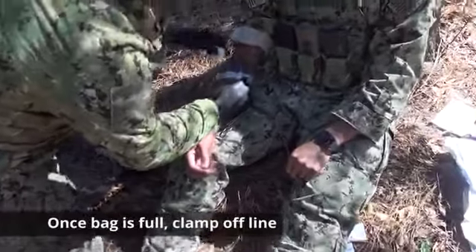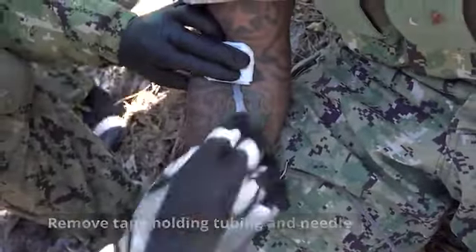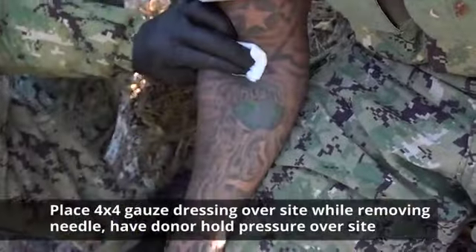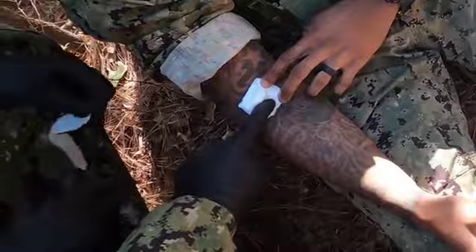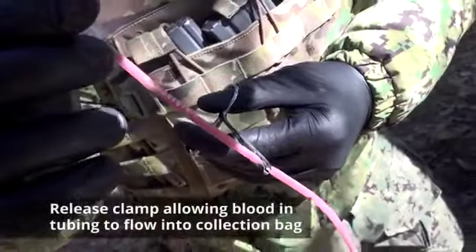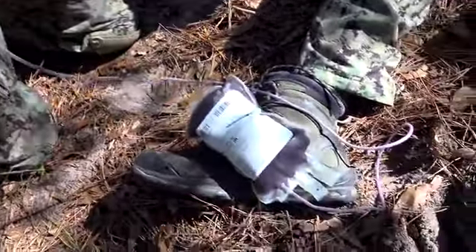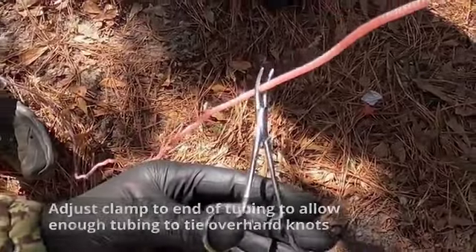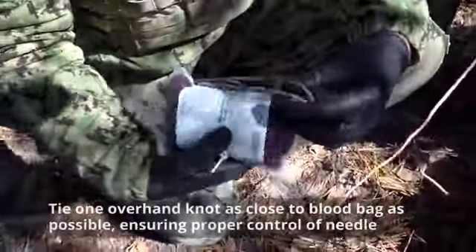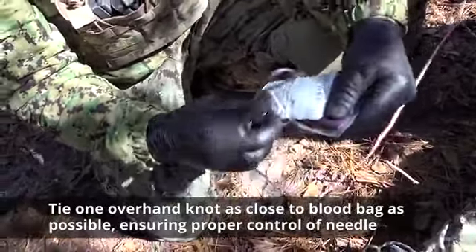Once the bag is full, clamp off the line. Remove the tape holding the tubing and needle in place. Place the 4x4 gauze dressing over the venipuncture site while removing the needle, and have the donor hold pressure over the site. Release the clamp and allow the blood in the tubing to flow into the collection bag. Adjust the clamp to the end of the tubing to allow enough tubing to tie overhand knots. Tie one overhand knot as close to the blood bag as possible, ensuring proper control of the needle as you tie.